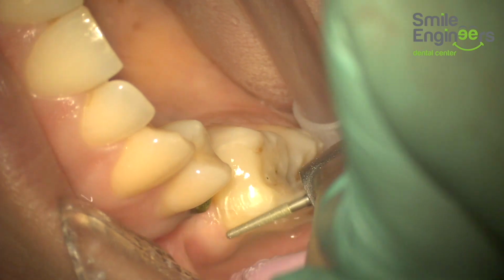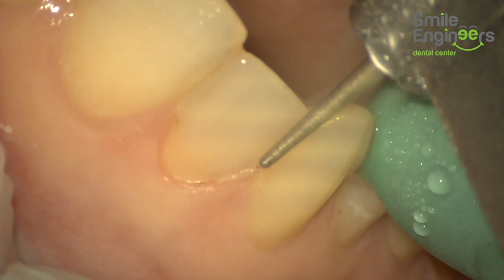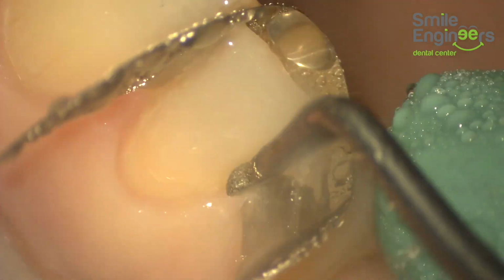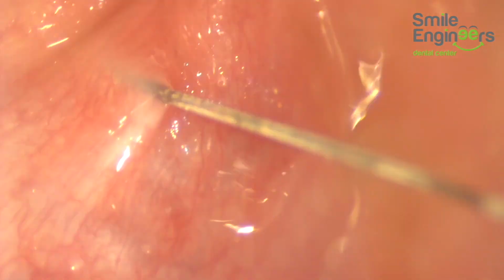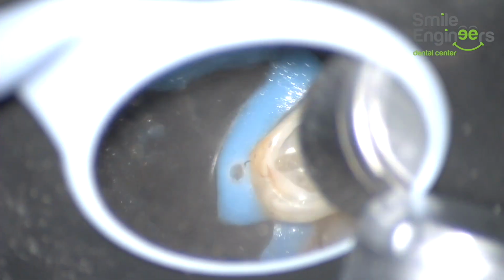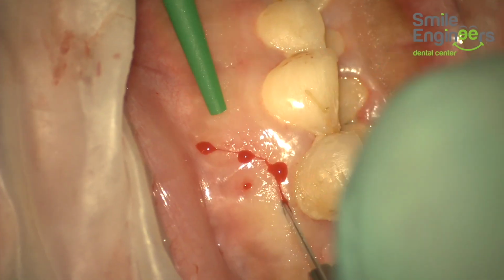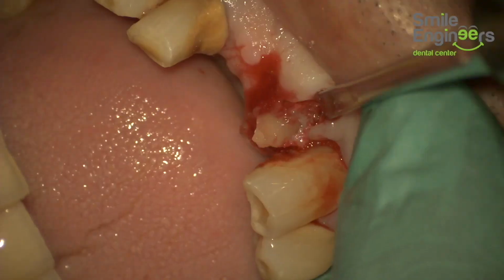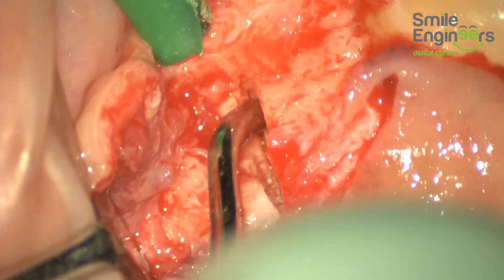Also for preparation of crowns, veneers, and finishing of it, and we can use it for immediate dentine sealing and the placement of the restorations. For retraction cord placement, even for the anesthesia, for margin checking before cementation, for post removals, for flaps, extractions, any kind of surgery that require bone removal or periapical surgeries.